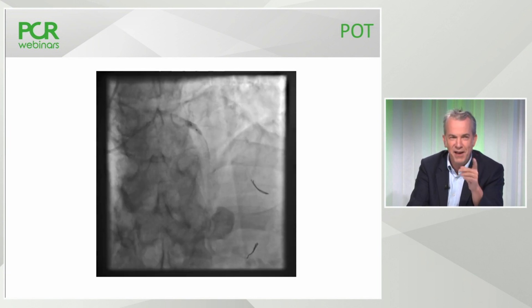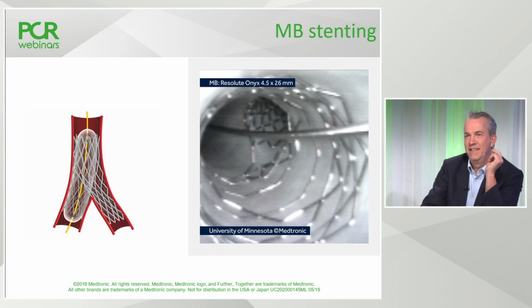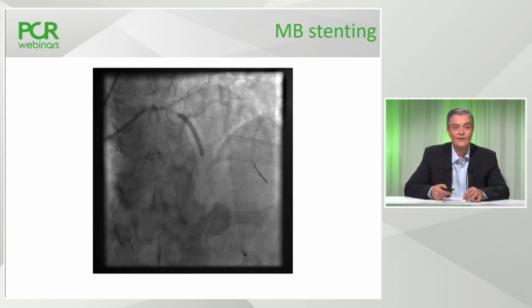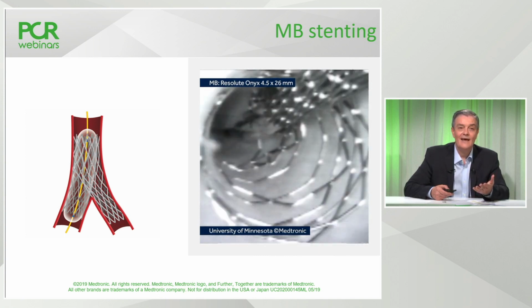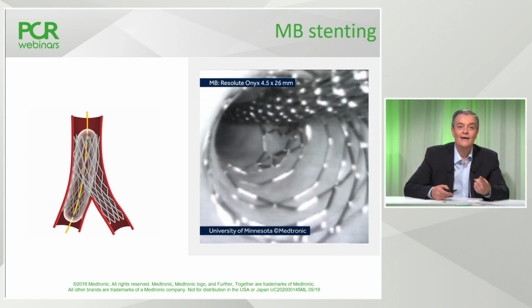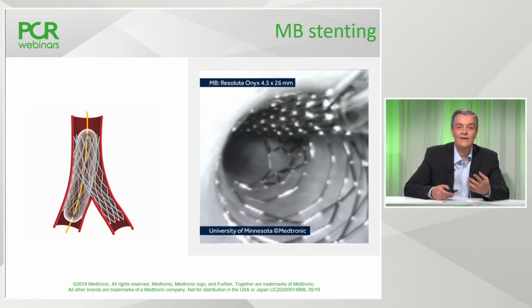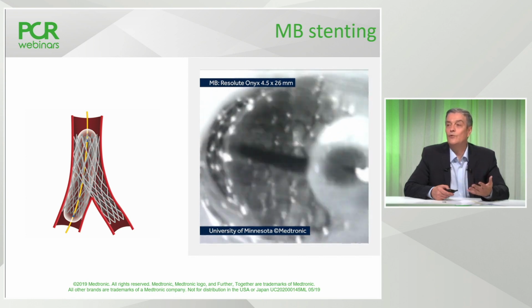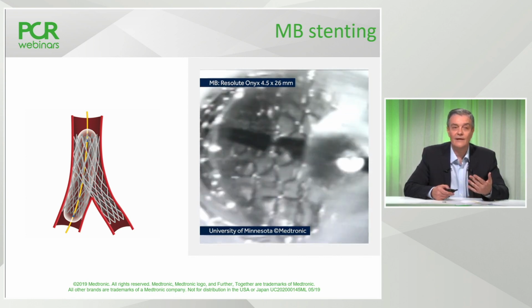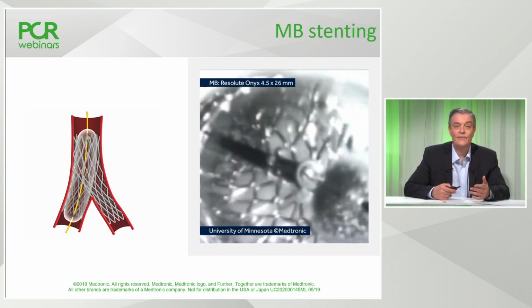Yes. And I'll go back now to the visible heart again. Okay, so we go back to visible heart just to demonstrate how stenting of the main vessel looks from inside. And you see now easy passage of the stent into the distal part of the main vessel. Here in this case, what we would do differently today, an unintentionally long overlap was performed.